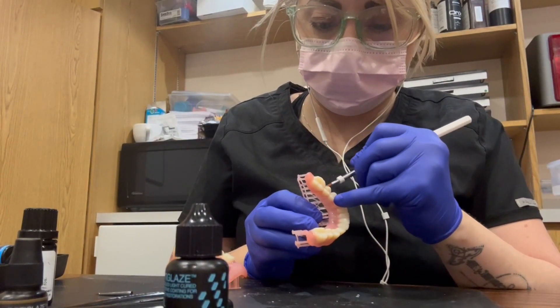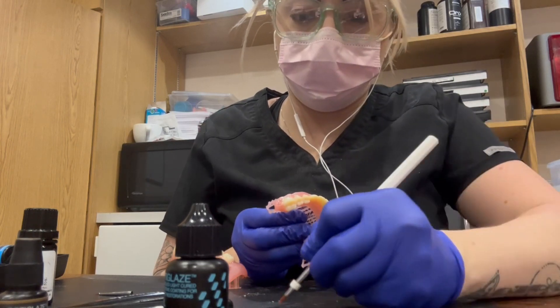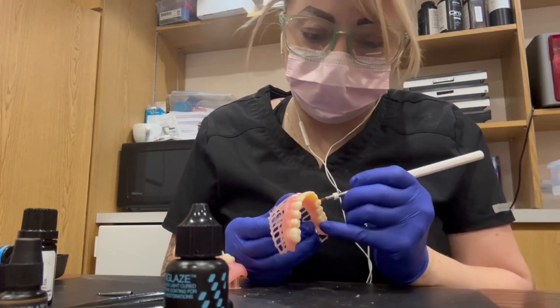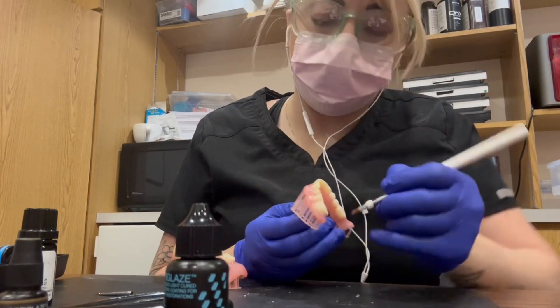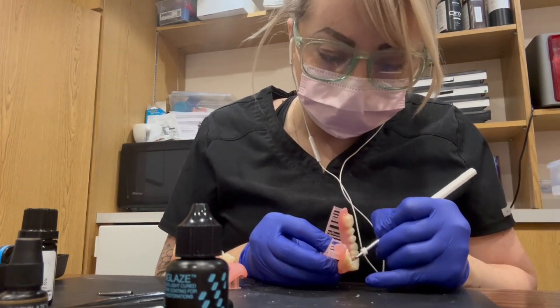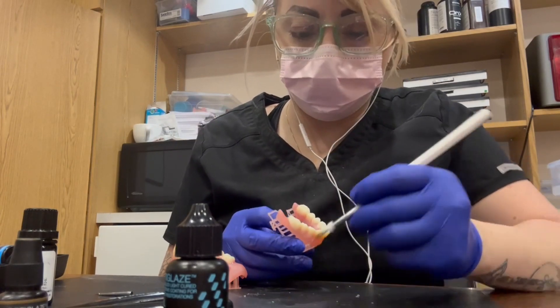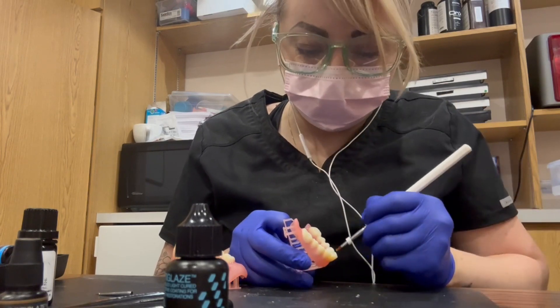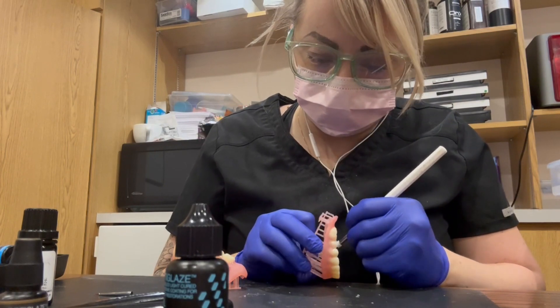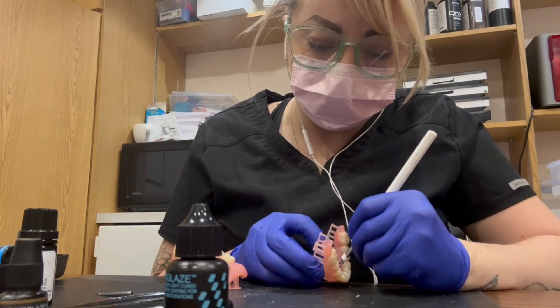I'm going to finish up — you'll see me quickly go over and paint a pretty thick amount. I like to use a black silicone mat for lots of reasons. That black matte color is great to take pictures of when posting. It doesn't mess with your eyes when you're trying to match a shade, so it's always good to have contrast up against it — you don't want white, lavender, or blue because it will throw off your eyes. You need good lighting and you need to know what's going to affect your vision to see the truest colors. So a nice thick coat all over the base again, and then a thin coat all over the teeth.